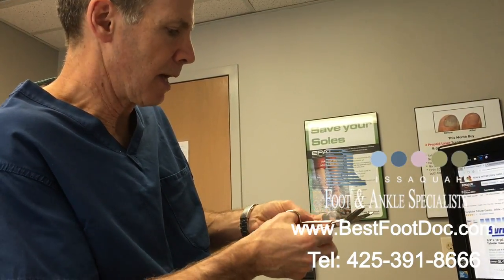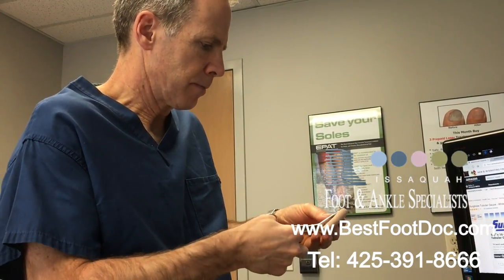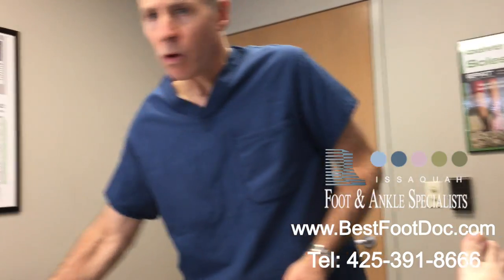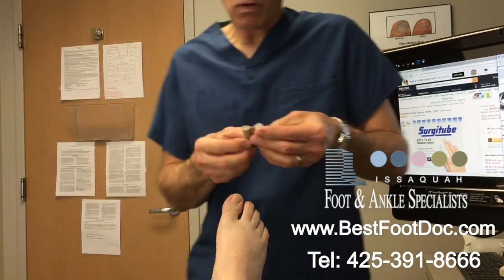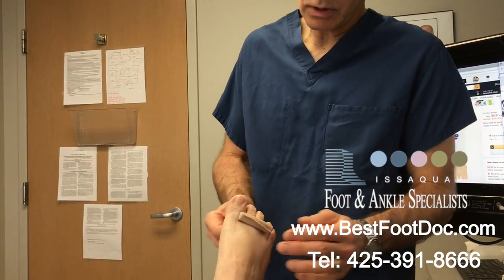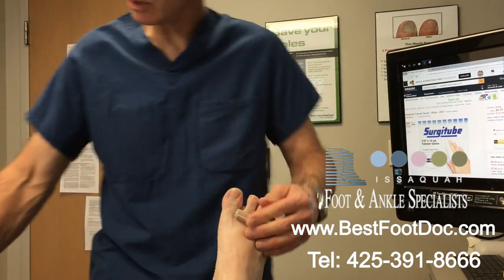You can do the same thing at the other end. You can make this for just one toe and it would fit over like that, or this could be for two or three toes. I'm going to put it over two toes. Remember, in the shoe it's going to push this down and this up. So this is really the same basic idea — these are homemade crest pads for hammer toes, and they work really, really well and they're quite comfortable.